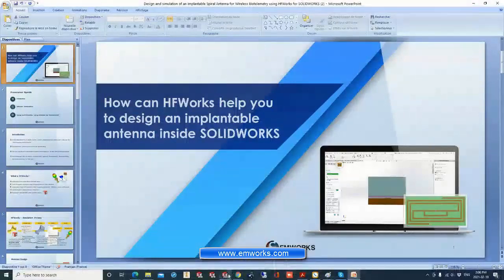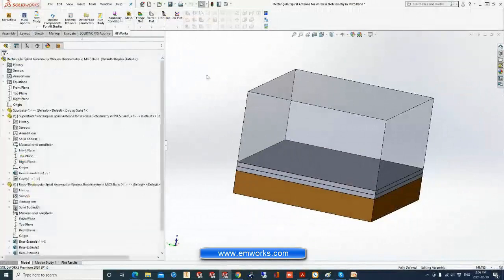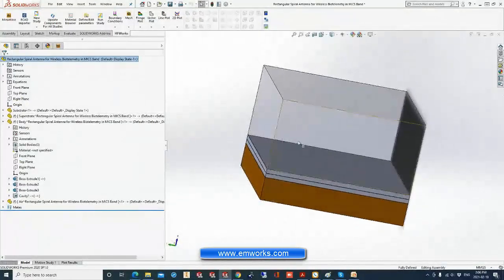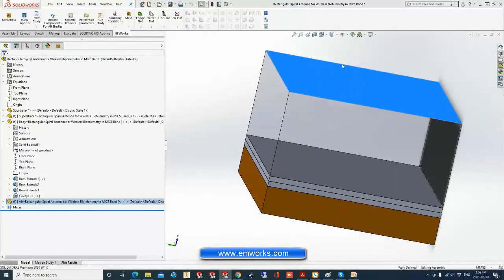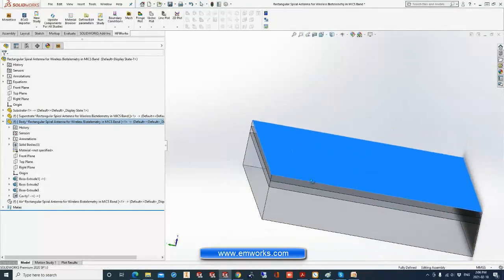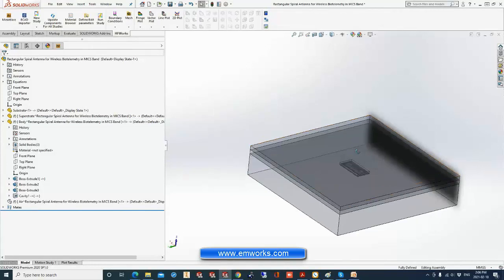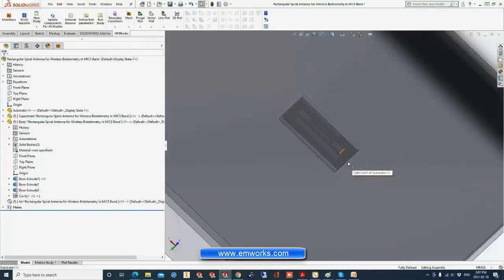Let's now see the software in action. So this is our model. We created the model inside SOLIDWORKS. So we have here 3 layers plus the air region. This is the air. Let me hide the air and change the transparency of the other layers. So this is our antenna inside the human body.